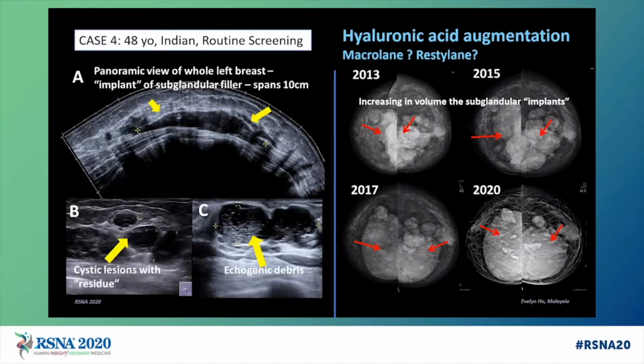injection augmentation, a rare instance when the patient could tell me what had been injected, but she could not tell which type was injected. She did not do anything else to her breast since that episode, but her serial mammograms showed the implants are growing, as if hygroscopic. I could not find any reports or info on this phenomenon and would be delighted to hear from anyone with similar experience of such findings. Please contact me by email. In the meantime, she's quite happy with her full breast and has been advised to see a plastic surgeon.